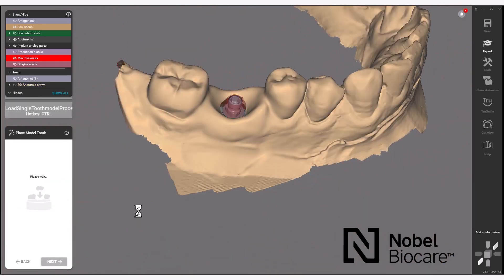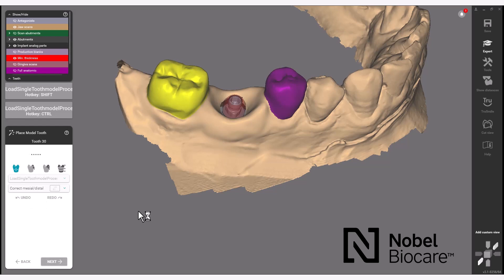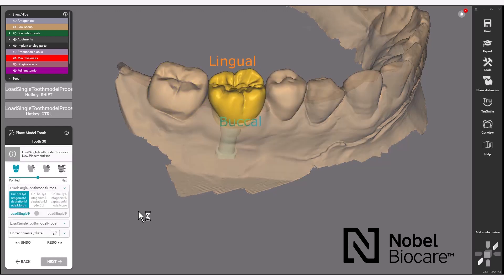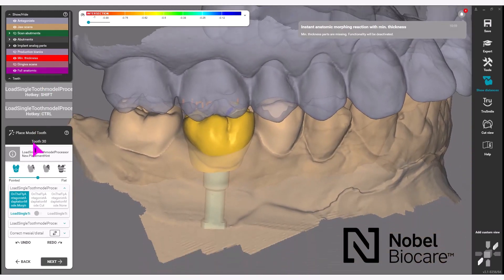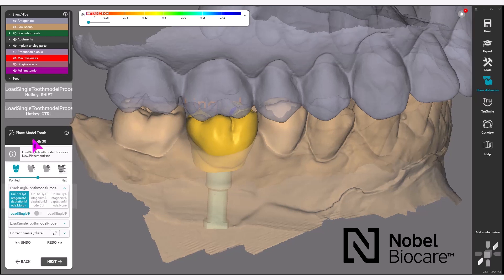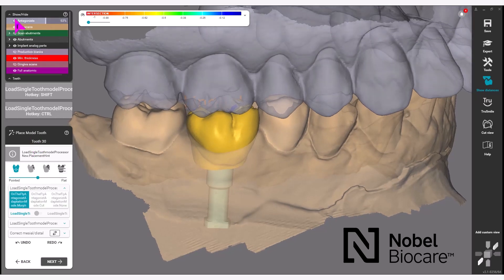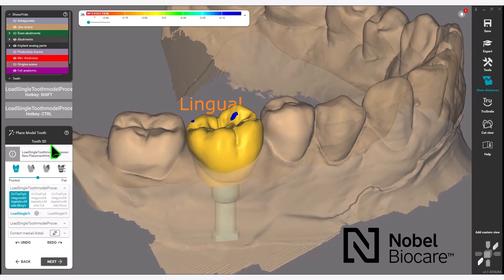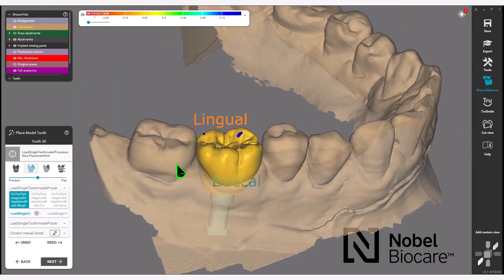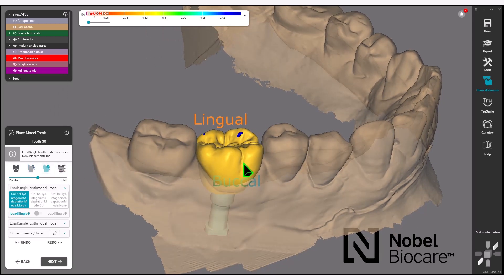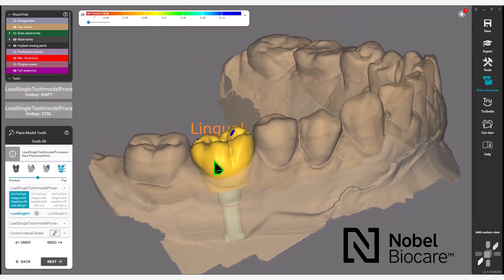Click Next in the wizard to proceed. When designing a crown, use the Place Model Tooth in the wizard. Use all the tools to adjust your crown to the desired positioning.